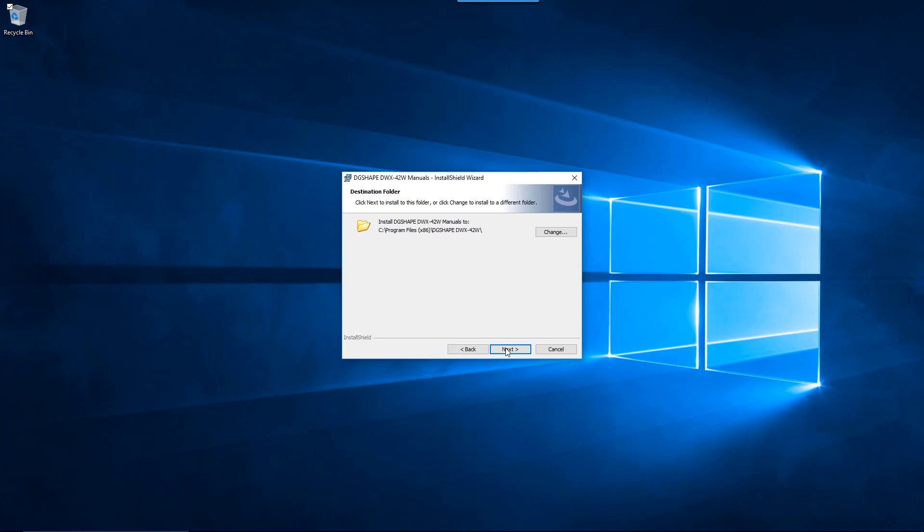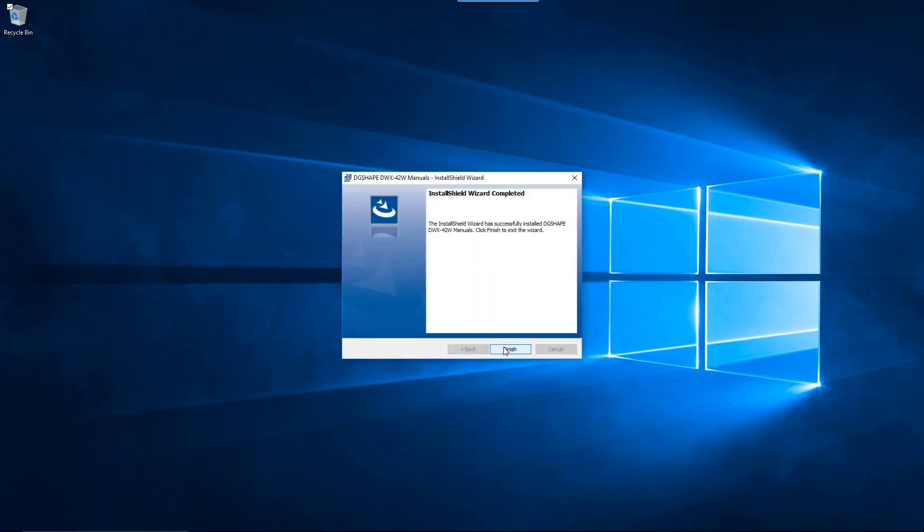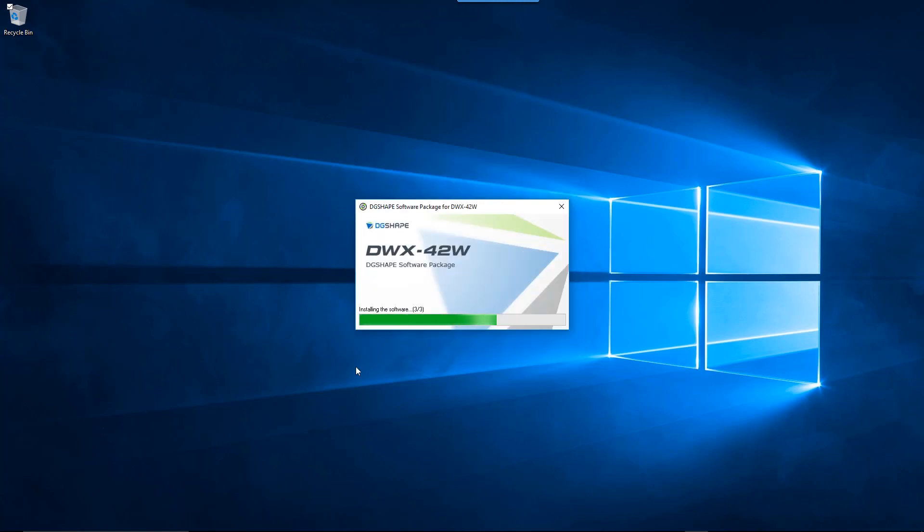The InstallShield wizard will display the saved location for the DWX-42W user manual. Click the Install button to start the installation process for the user manual. Once the user manual has completed installation, click the OK button to complete the process.